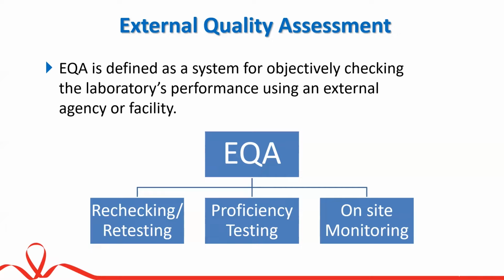Similarly, for the CD4 and viral load laboratories, NARI is conducting proficiency testing or external quality assessment programs. Basically, this external quality assessment program has three arms. One is rechecking, which is implemented between the state reference laboratory and ICTC, where the ICTC sends some samples with known results to the higher tier laboratories, and the higher tier laboratories retest and compare the results, so that the performance of the ICTCs is monitored, right?